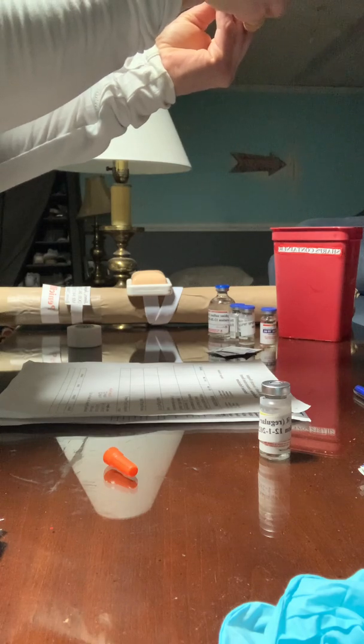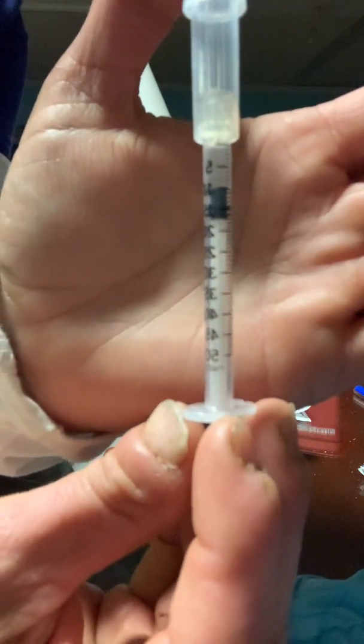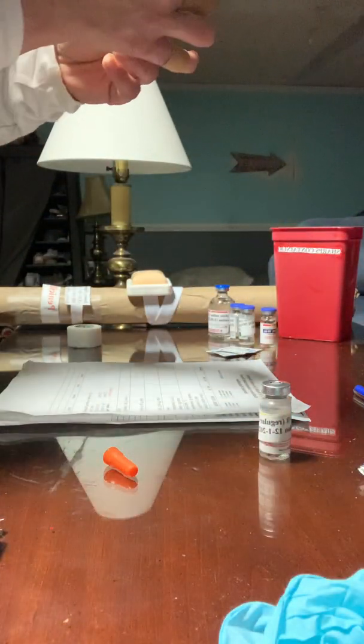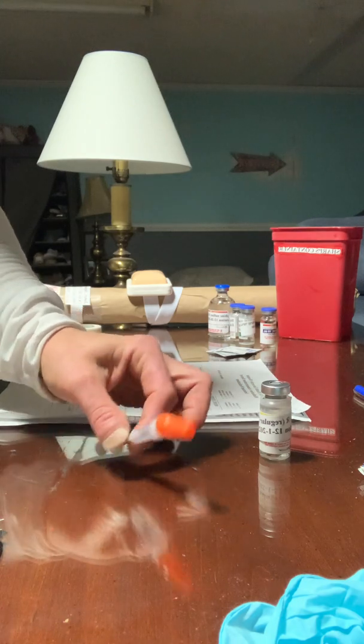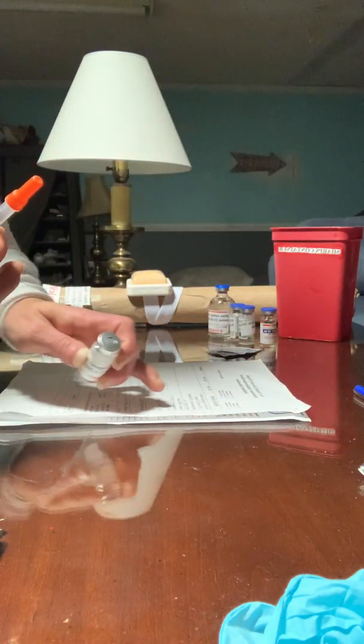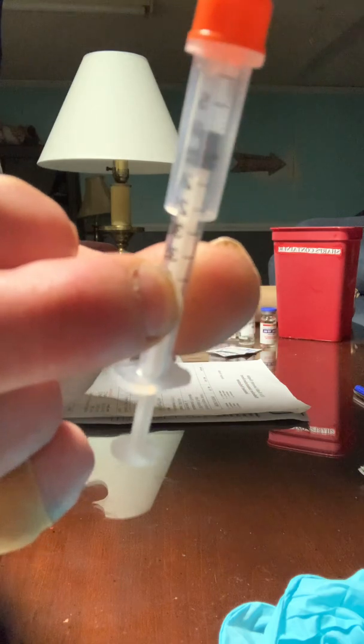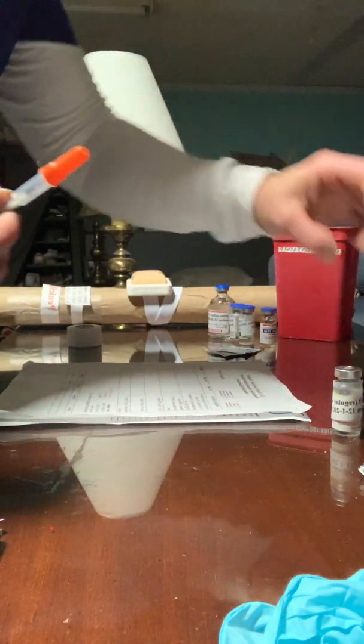At this time, I would also verify, if needed, any calculations with another nurse. I got 10 units. Can you see that? 10 units. Okay. So I will use the scoop method to scoop the cap back up. Now I have Novolin R regular insulin, 10 units, subcutaneously. This is a good subcutaneous needle. It is to be given 30 minutes before meals, and it is 30 minutes before his meal. He has not had this medication within the last several hours, so it is safe to proceed.